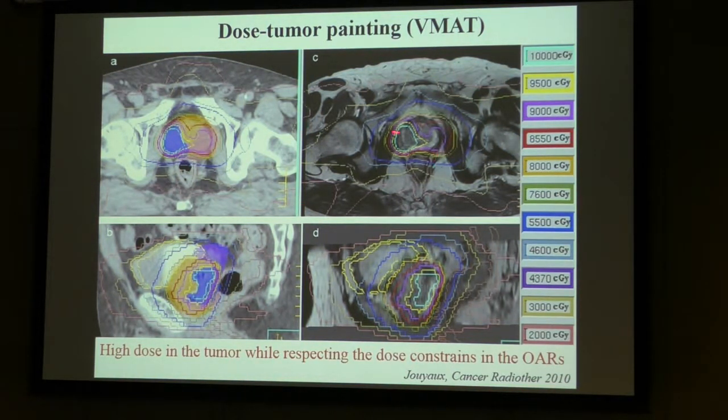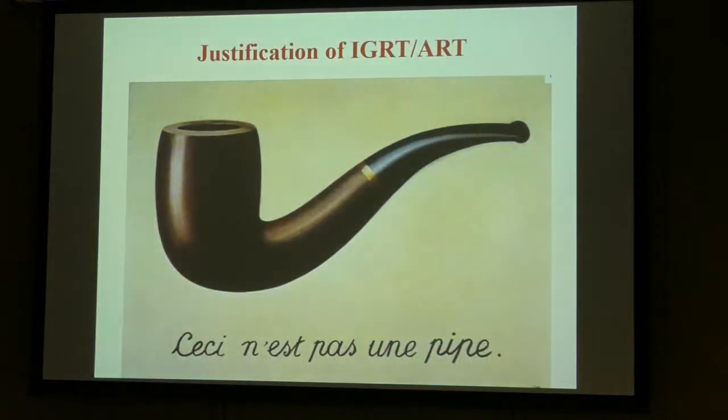And in the paper it appears feasible, let's consider the prostate, to even increase the dose inside the prostate up to 100 gray. This is only a dosimetric study, not a clinical study, while sparing the organs at risk, respecting the dose constraints. This is on the paper. But what was really forgotten is that painting.